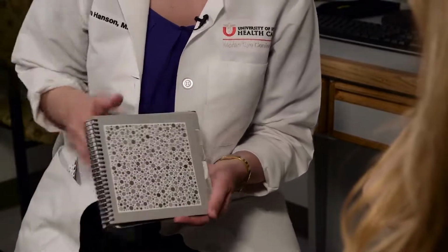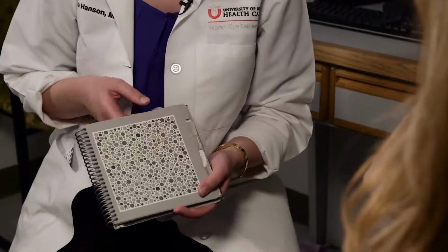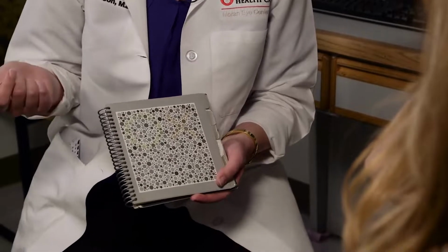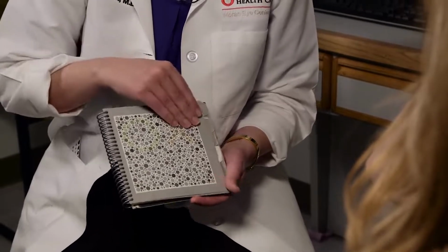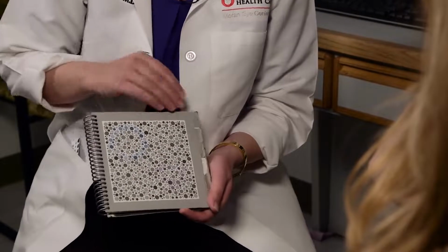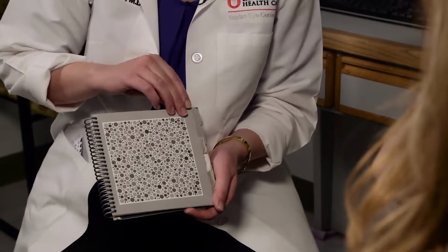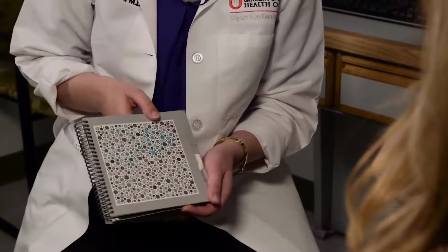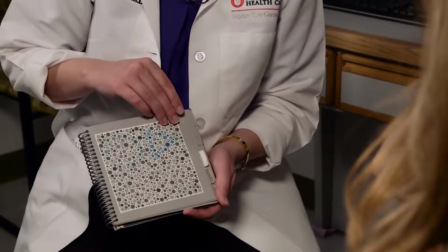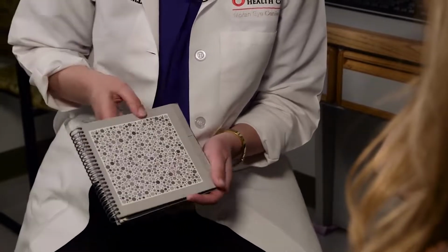The 4th is a blank plate. And then the next 6 plates are the screening test. And so again, you have the patient test one eye at a time, ask them to go through each of the plates. X. Just a 0. X triangle. O triangle. O. X. Very good. And then you can do the same thing with the other eye.